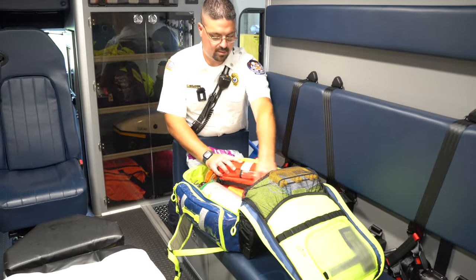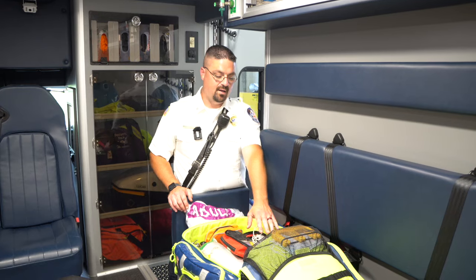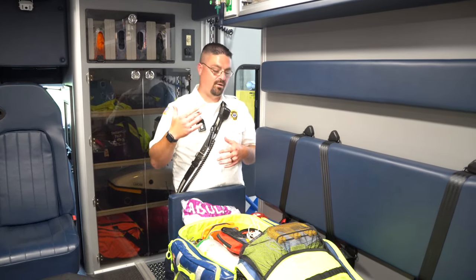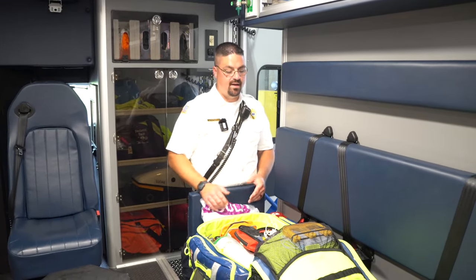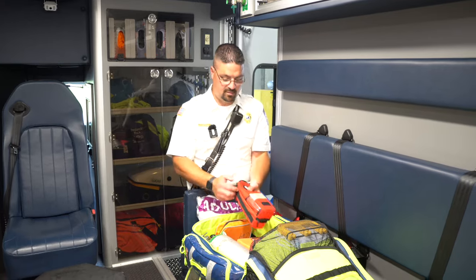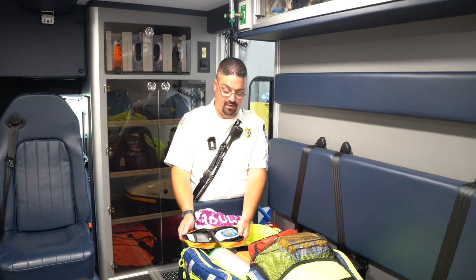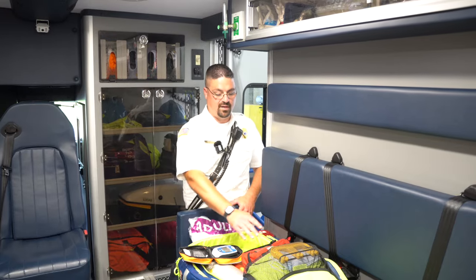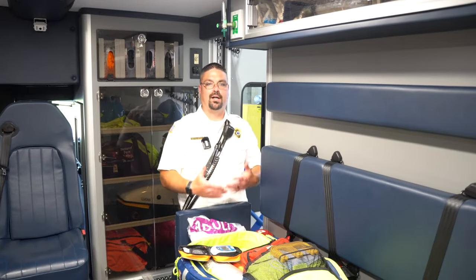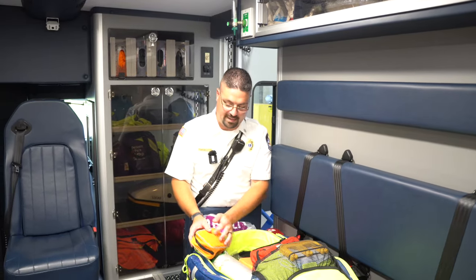We have a Rad-57, which doubles as a pulse oximeter and reads CO — carbon monoxide — levels. So if anyone is coming out of a fire or a leak in their house, we can test that. We also have a glucometer to check blood sugar. The brain runs off sugar and oxygen — if we check the oxygen and the sugar we can work through our algorithm of AEIOU-TIPS to figure out why they're not acting appropriately.